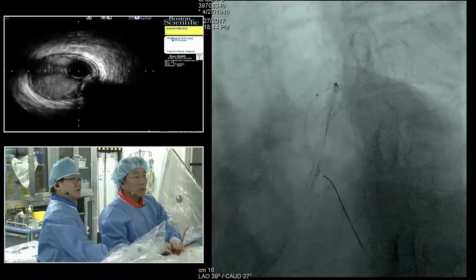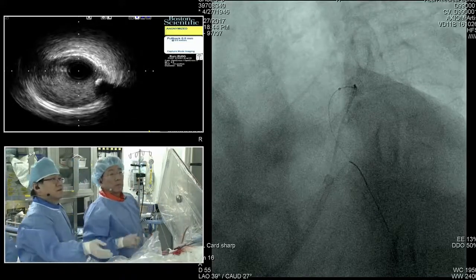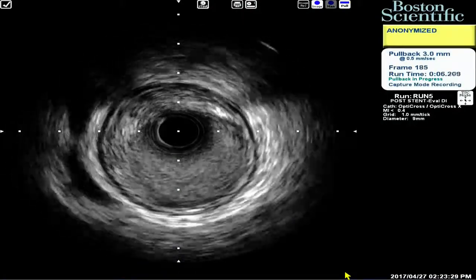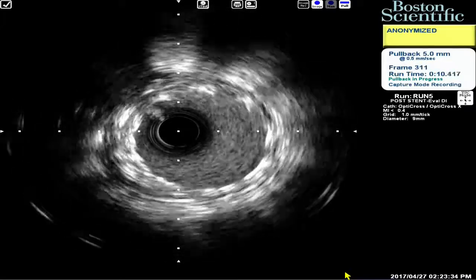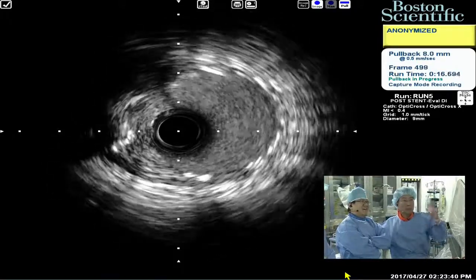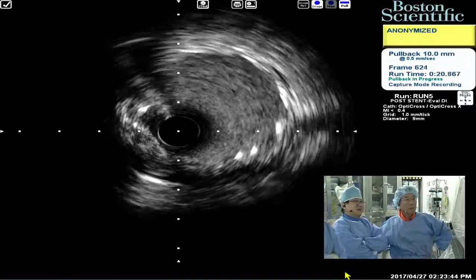Just the distal. Okay, this is a normal looking area. All right, good. I like it. Can you read this one? Okay, read here. So distal landing is perfect. I like it. All right. Full lesion coverage. Very expanded stent and normal apposition.